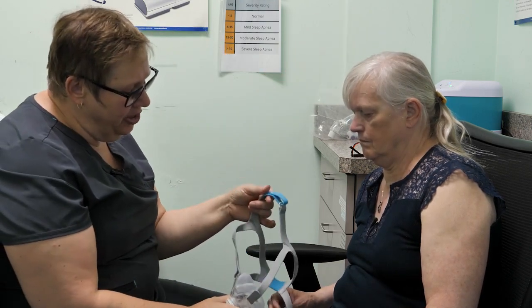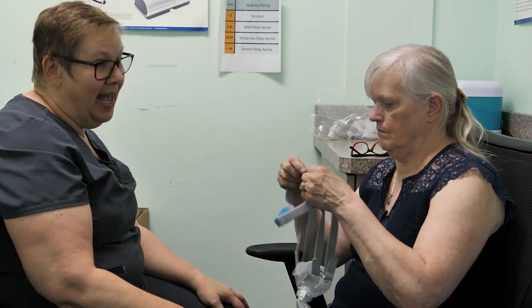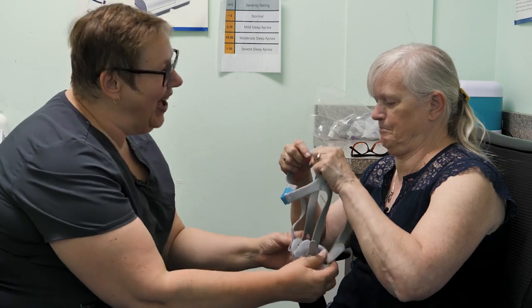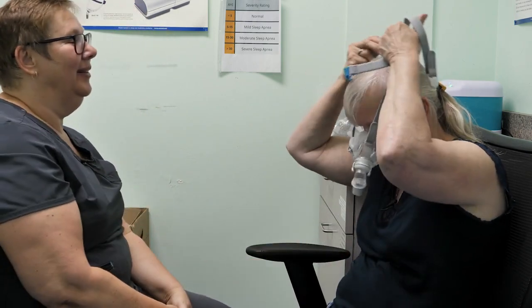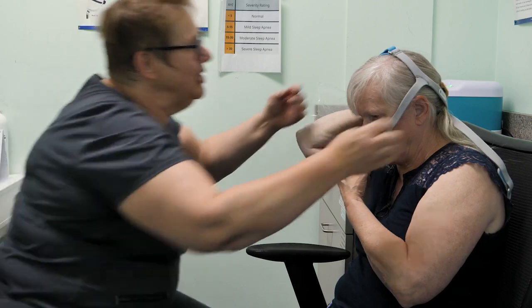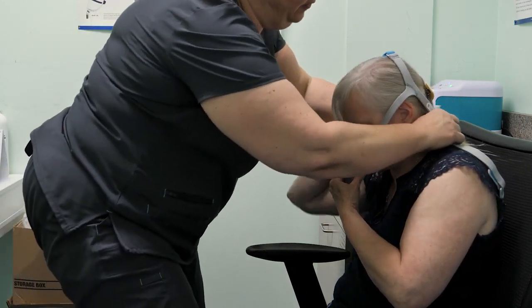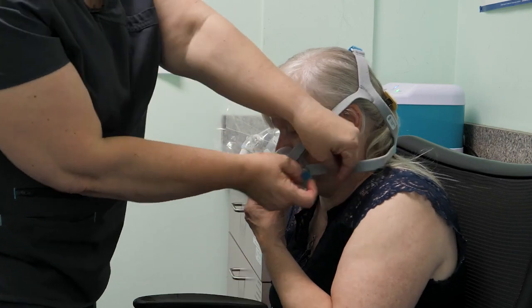And then you're going to put the mask on the way I showed you. Do not do up the clips yet, and I'm going to show you why. And that happens all the time because those magnets are strong. And you're just going to put it on there. All right, now I'm just going to adjust the headgear for you. So you are so tiny and petite there, my dear.